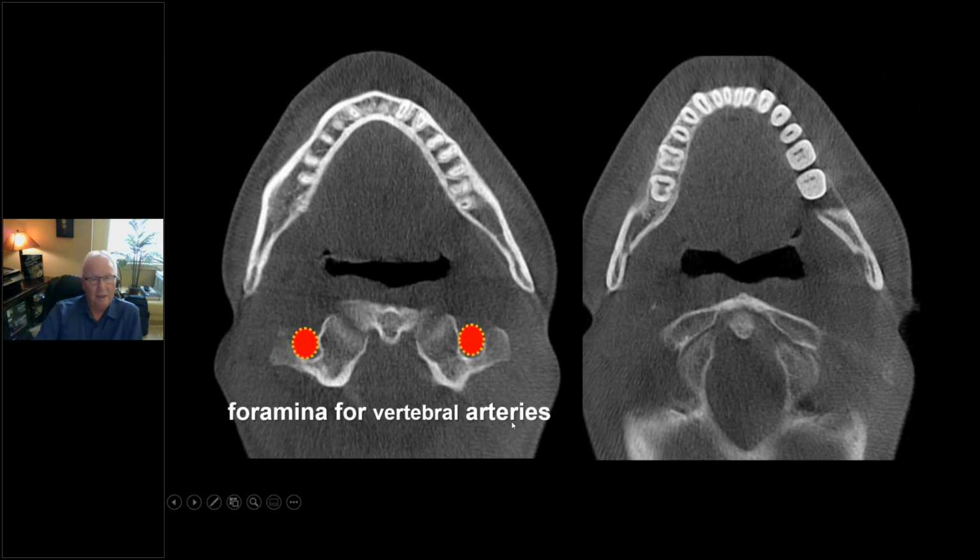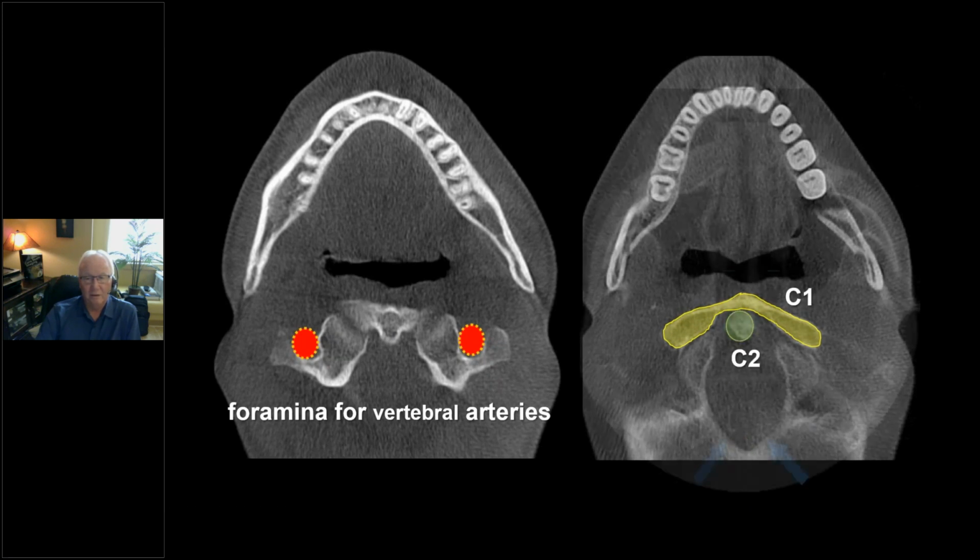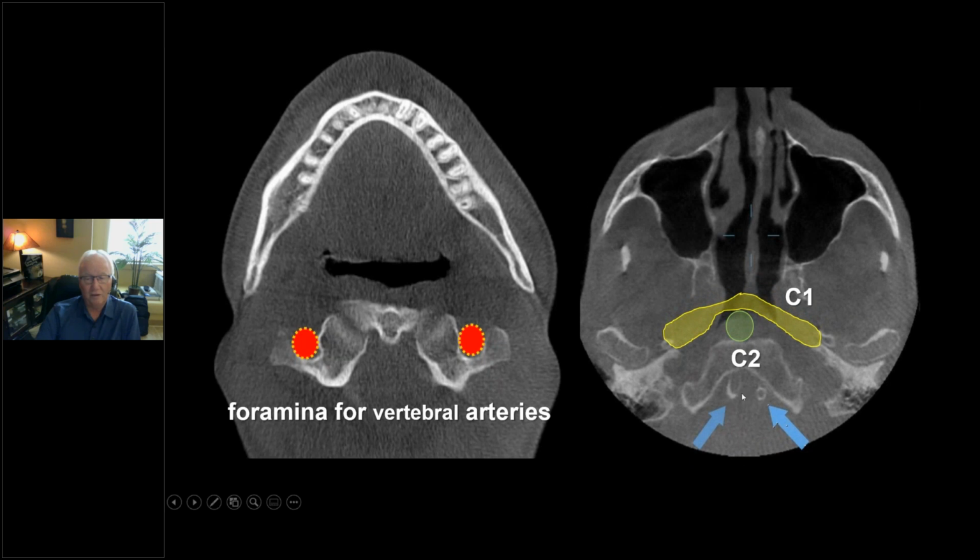I also see, this is mandible, obviously. You can see the airway, you can see the dens, and this is the anterior arch of C1. This is the foramen magnum. This is the vertebral artery. It comes up and then goes in through the foramen magnum a little bit higher up. So in this area, between C1 and C2, I often see calcifications. These are arterial calcifications in the medial layer in the vertebral arteries. Well, there's condyles. Are you going to see them? Yeah, you're going to see them. You probably will miss them until you start looking.